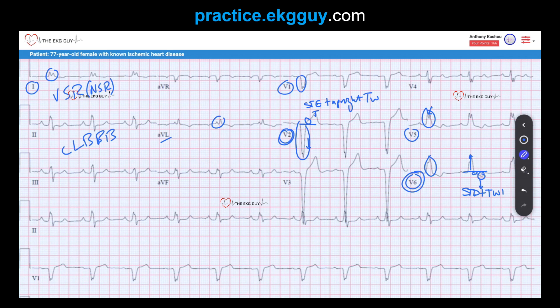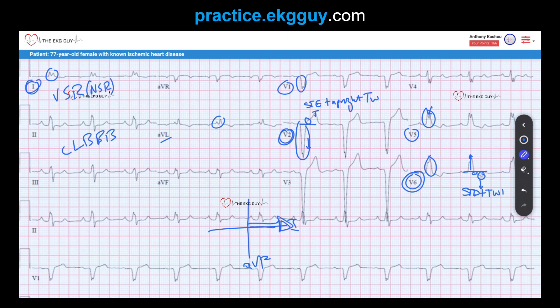A final point on the ECG: the main QRS axis is actually normal at positive 20 degrees. In some cases, left bundle branch block can result in left axis deviation. While this could help support the diagnosis, it is not a required feature. Lead 1 is mostly positive, AVF also mostly positive, and lead 2 at positive 60 degrees is also heading toward it — placing this in a normal axis range, though it can sometimes fall into left axis deviation range. Left axis deviation is not a requisite for the diagnosis of left bundle branch block.